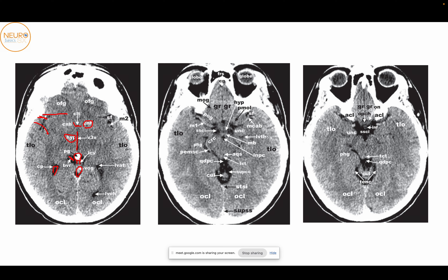Coming a little bit more inferiorly, we start seeing the suprasellar structures — below the third ventricle and below the hypothalamus. We can make out the mammillary bodies, the two globular structures below the hypothalamus. At the level of the orbits, these two straight-looking gyri are the gyrus rectus. To identify the gyrus rectus, come down to this level where you can see only a narrow portion of the frontal lobe — this region would be the gyrus rectus, not higher than this. Apart from that, you can see a hyperdense MCA, the sylvian fissure, and the uncus. It's always important to identify the uncus and look for the cisternal spaces between the uncus and the crus cerebri to make sure there is no cerebral edema and the cisterns are not obliterated.